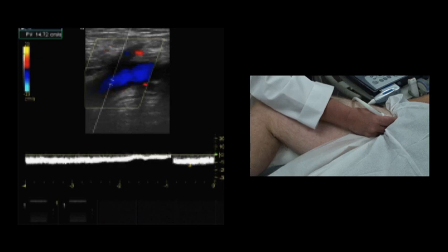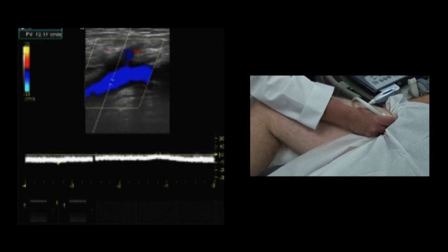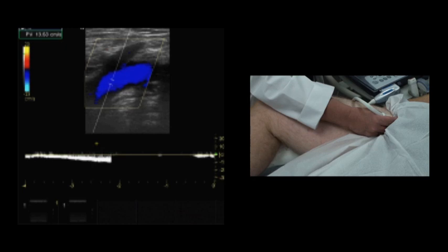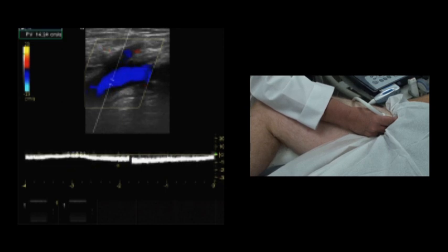Also with color is going to be very beneficial because we should see red that will indicate that there is reflux. Take in a good deep breath again and hold it and bear down. Let it out. And did we see, we saw red for a little while. That is indicating that there is reflux. We also saw the indication of the spectral in reverse flow.